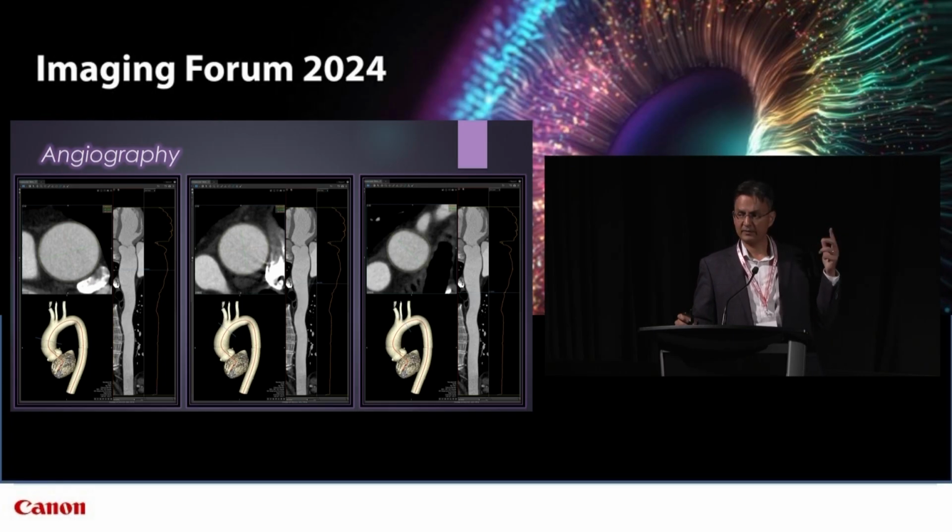If either of those segments are dilated, it'll change the type of surgical approach. It usually goes proximal to distal in terms of dilation. So if it's just the proximal, it would be an ascending aortic reconstruction. If you've got involvement of the proximal arch just near the brachiocephalic trunk, they may do a hemiarch reconstruction, and if you've got involvement of the arch near the subclavian, it may require either a total arch reconstruction or a staged procedure where the second procedure could be a TEVAR and a stent graft placed from a femoral approach.